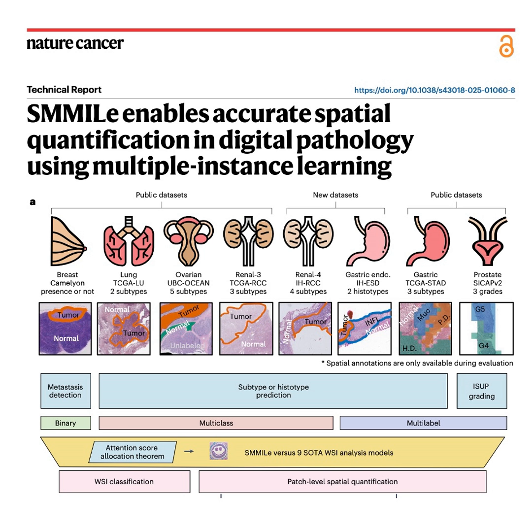And if we look at the broader implications of this, this isn't just about saving a pathologist some time at a microscope. It's about opening up entirely new avenues of quantitative analysis. Because SMMILe perfectly maps tissue phenotypes without needing human hand-holding, researchers can now conduct massive, automated retrospective studies. They can feed thousands of historical patient slides into the system, perfectly map the mixed tumor heterogeneity, and analyze how the exact proportion of different tumor subtypes in a single patient correlates with their survival rate or their response to a specific drug. Precisely. It turns a qualitative human judgment into a highly structured, measurable data pipeline. That leads directly to better prognostic evaluations and highly targeted genomic therapies.